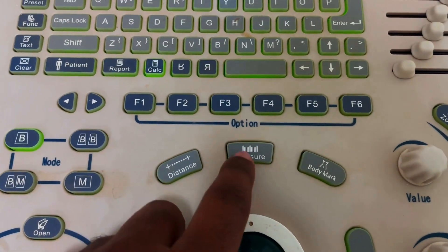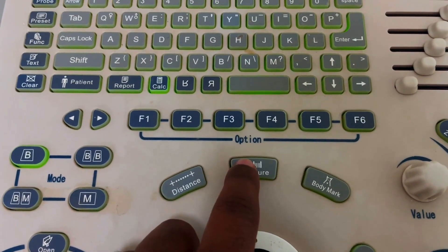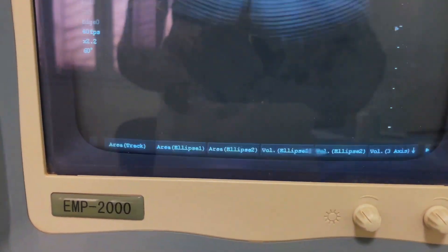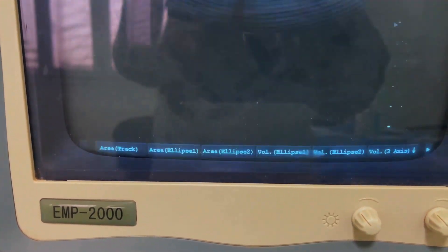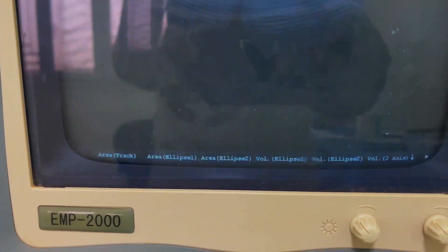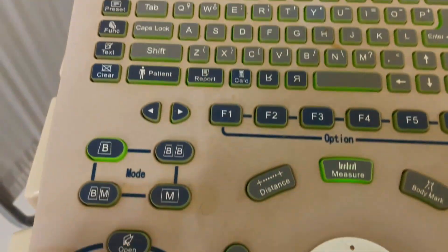Here is the measure button. You can measure other types of parameters such as area and volume — all are available here.